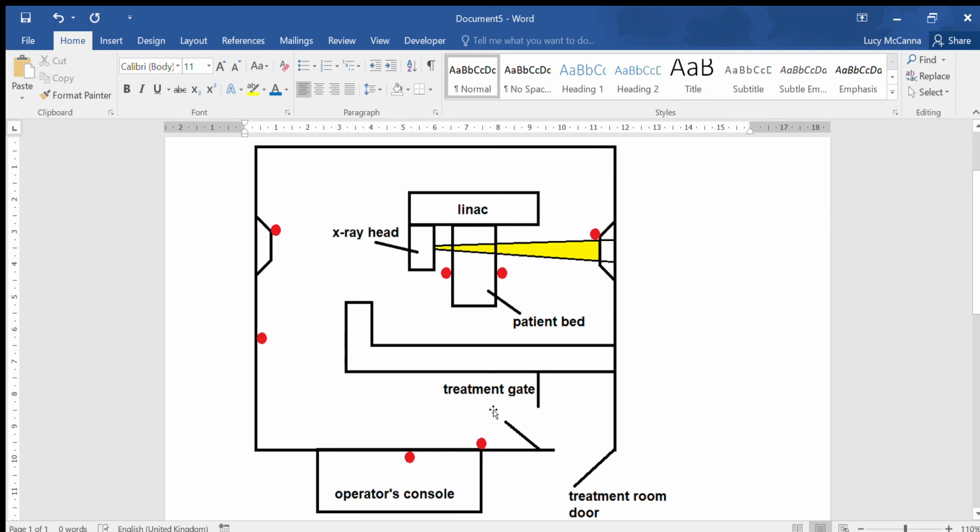So what you can't see on the diagram, but what would be in this room, is radiation detectors monitoring the radiation levels in the room. There's legislative limits to exposure to radiation for the general public, treatment patients, and also members of staff. These monitors would be just continually monitoring radiation within a room, checking that it is within acceptable levels even for someone undergoing radiotherapy, and certainly technicians delivering radiotherapy. And this would just be a continual monitoring.